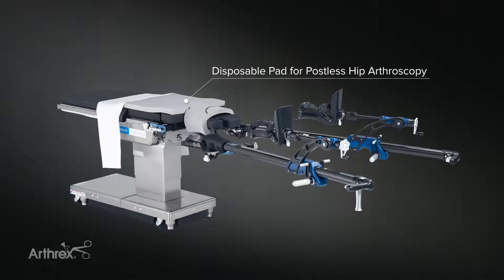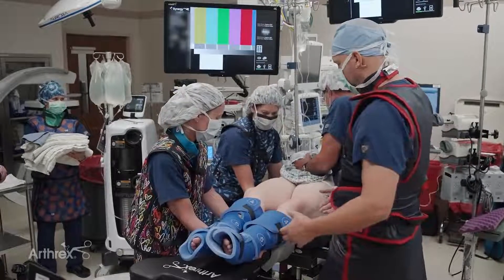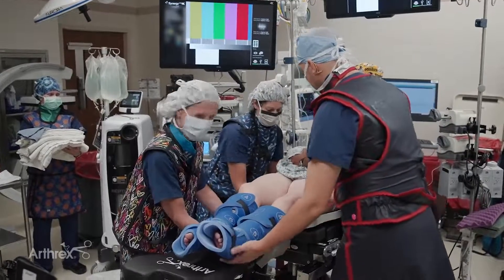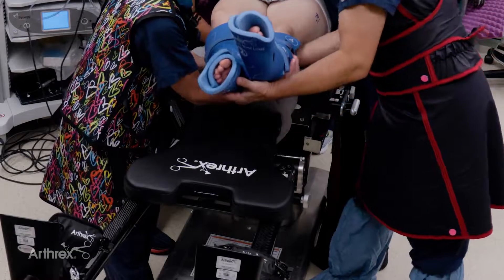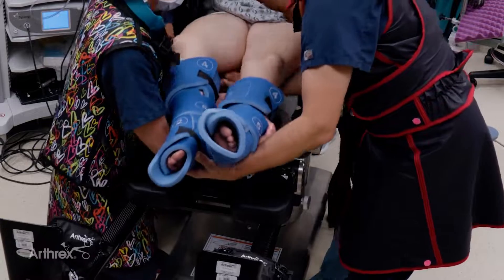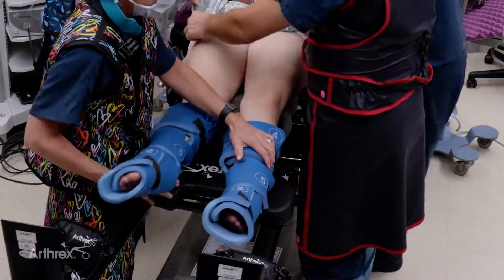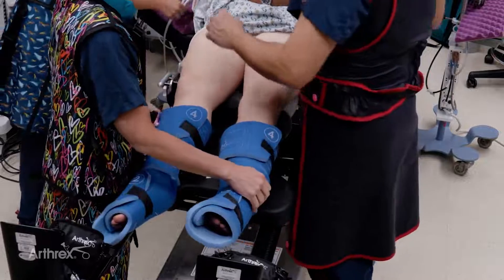This is the technique for postless hip arthroscopy positioning. The patient has been anesthetized, and we're now moving the patient down into the appropriate position, and then we'll apply traction in the next steps. The first step is to have the team all together. We move the patient into the same position as we would be in if we were doing posted hip arthroscopy.